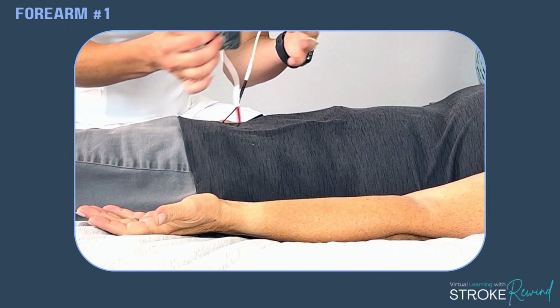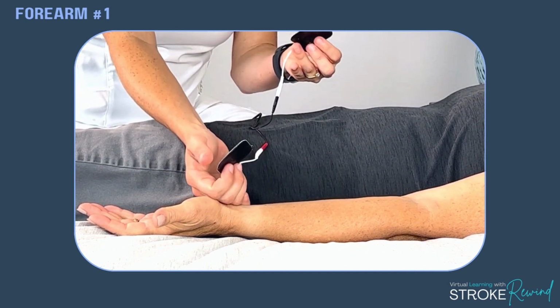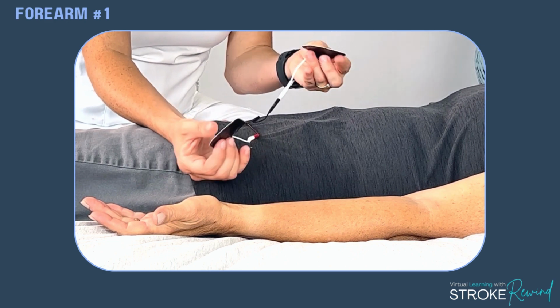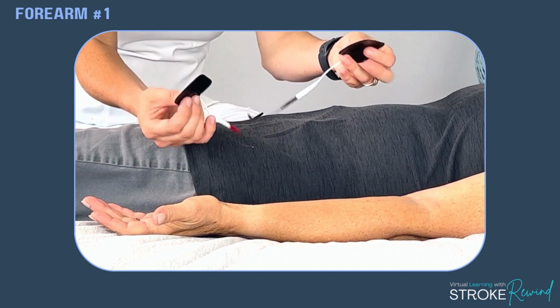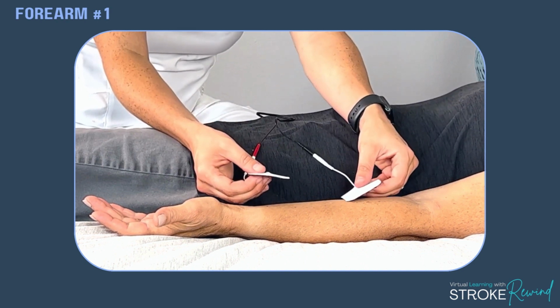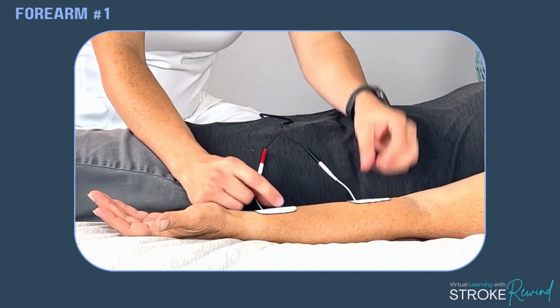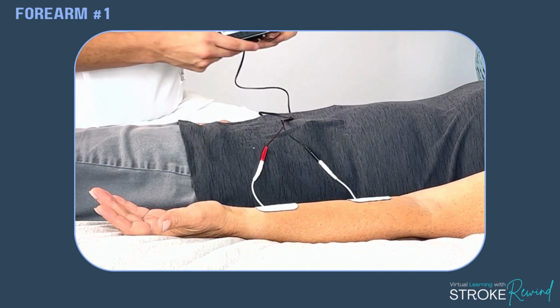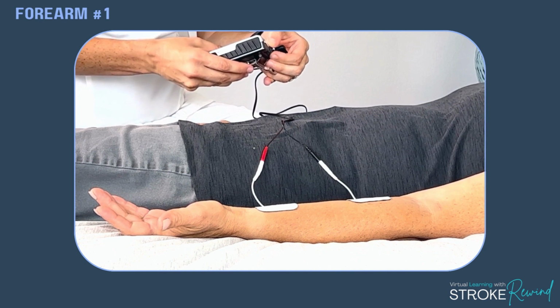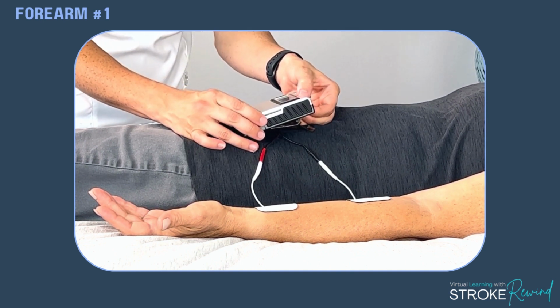Let's move on to the lower arm or the forearm. So I have her laying on her back for this demonstration, but you could have the person sitting up or laying on their side. But again, you're going to take the electrodes. I like to do the black over the red, the cord. You're just going to find a meaty part of the arm. You're going to place those. You're going to go through the same routine. You're going to turn it on. You're going to let her know I'm turning on the machine. Now let me know when you can feel it.